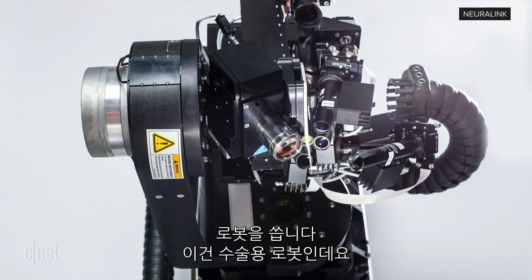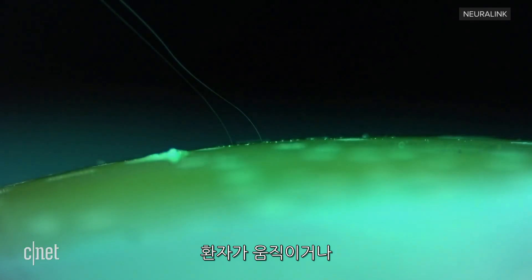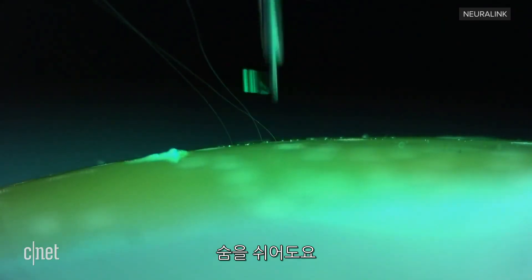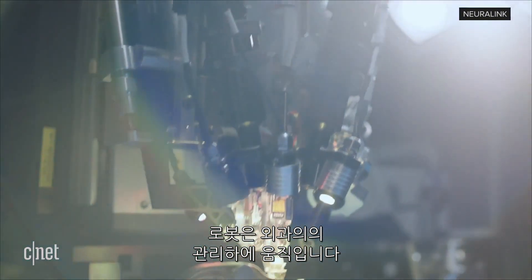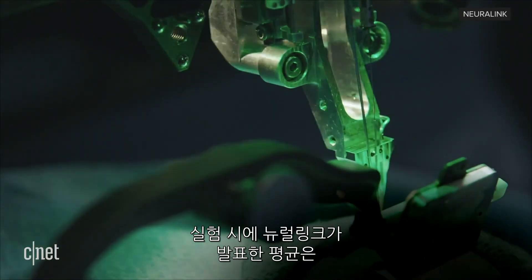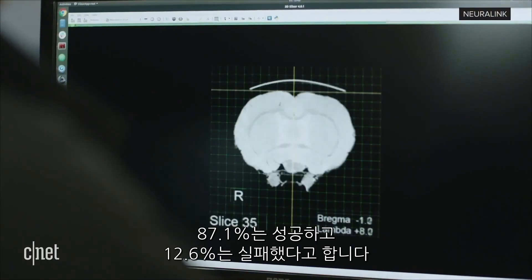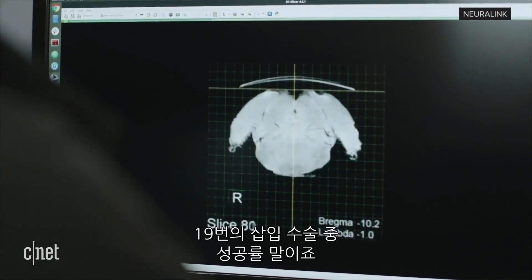This is a surgical robot that deals with the complexity of the surgery, such as the subject moving due to breathing. The robot is under the supervision of a surgeon as electrode threads are implanted. In tests, Neuralink demonstrated an average of 87.1 plus or minus 12.6% insertion success rate over 19 surgeries.